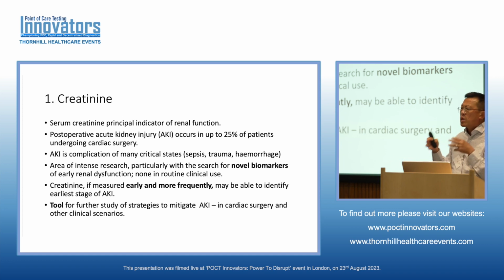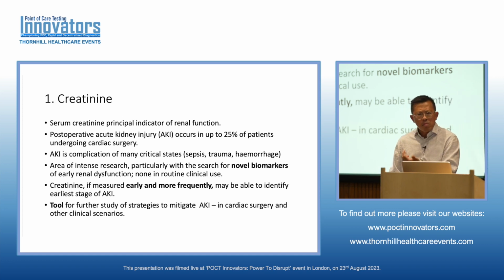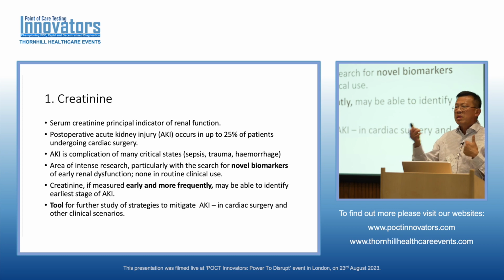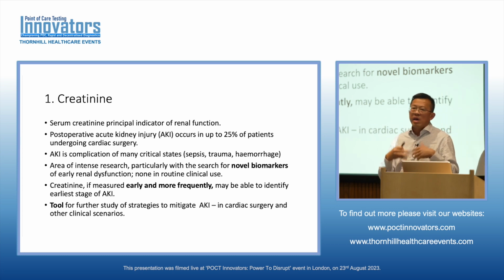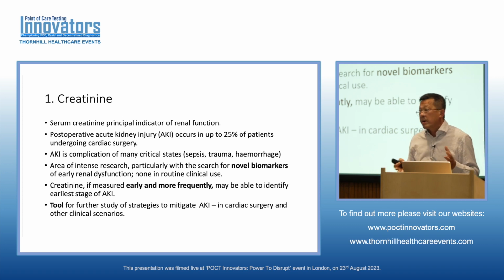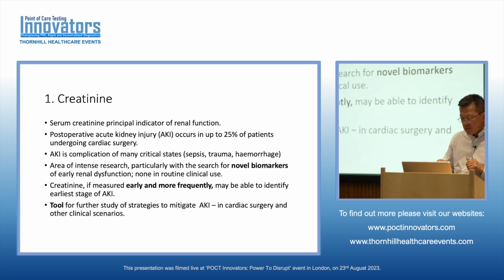That early detection will allow you to intervene early. But have we looked at early changes in creatinine? We haven't. We haven't because by and large, we just assume that the laboratory gives us a creatinine value and it would be pointless to measure creatinine more than once a day or at the most twice a day. And so it's quite possible, in my view, that we have a potentially useful, potentially early marker of AKI there, but we don't realize it because we don't test it frequently enough. Yeah. So that is kind of my pitch for creatinine at point of care.